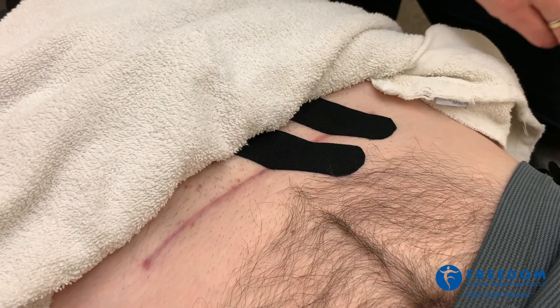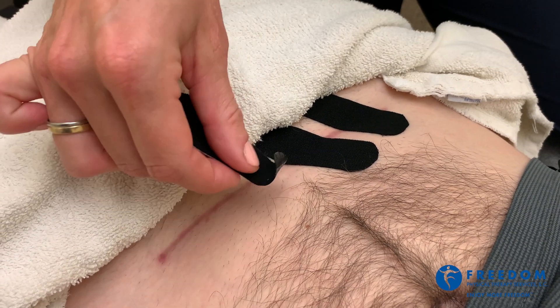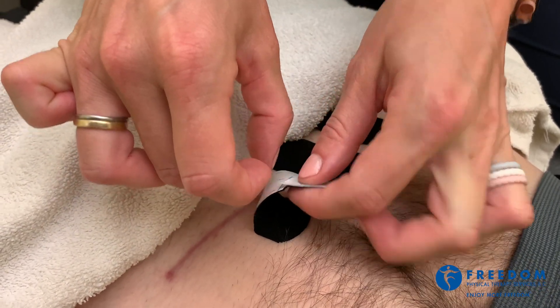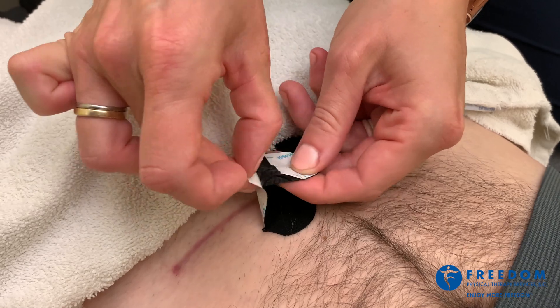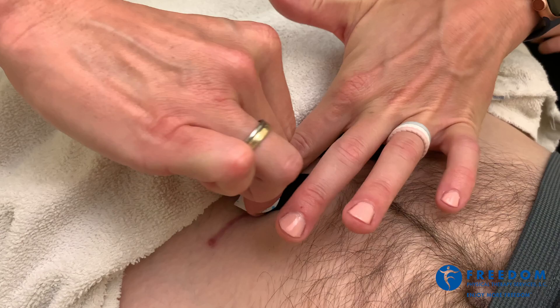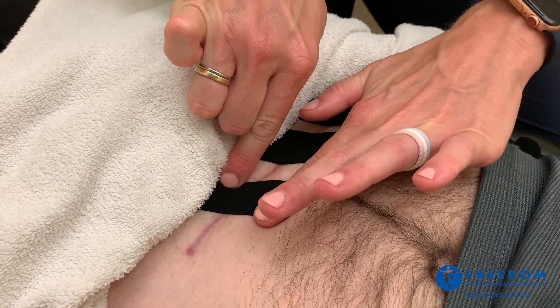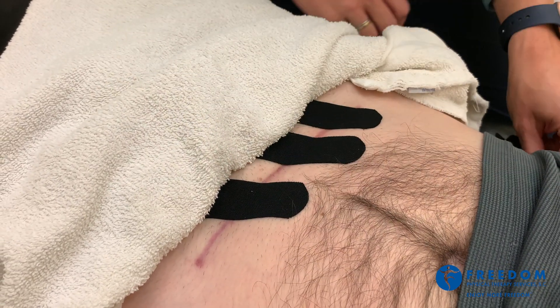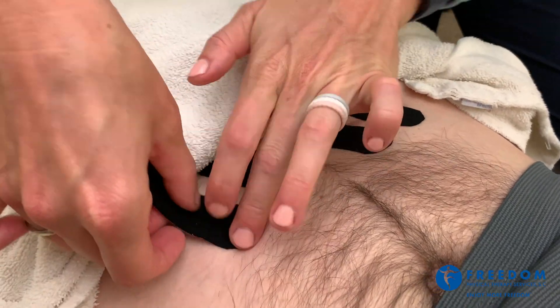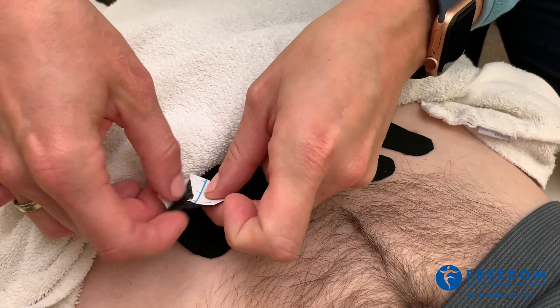We'll definitely give you adhesive remover. Now what this does is, as this person moves throughout their day with regular spontaneous movement, the tape will pull and tug in different directions, helping to loosen up the adhesions underneath the scar, making it more mobile and breaking it free from the deeper tissue.